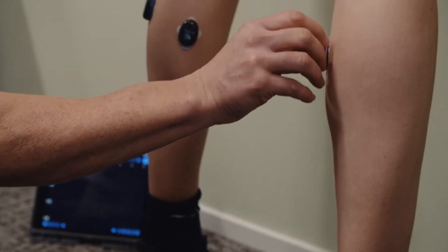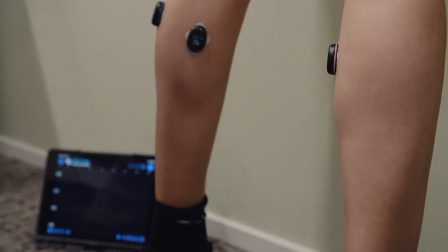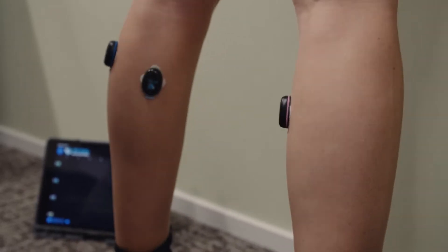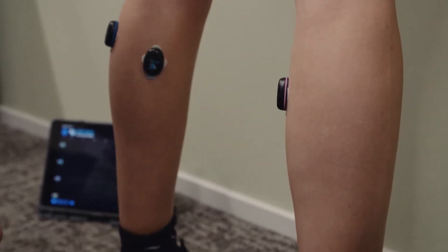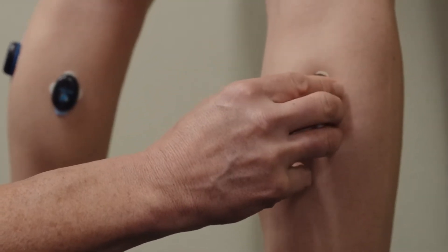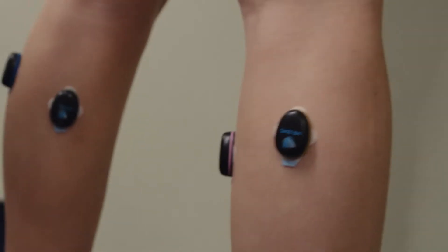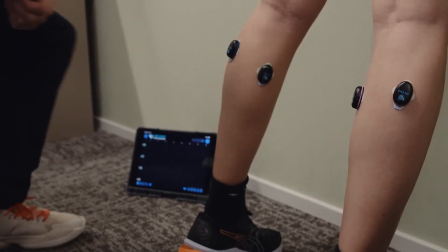Begin by placing Mr. EMG's sensors on your subject's medial and lateral gastrocnemius muscles, with them standing facing away from you. Follow our recommended muscle placement sites.